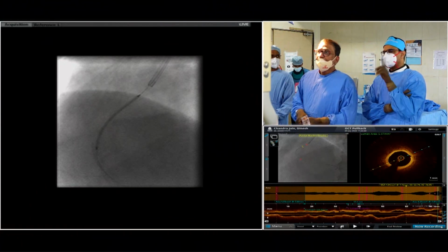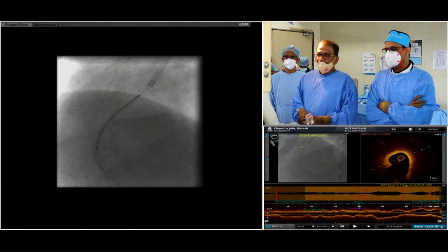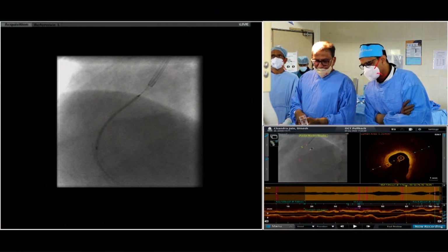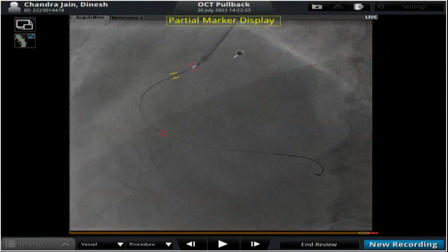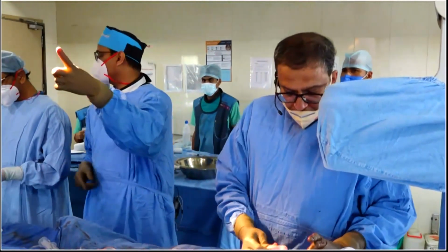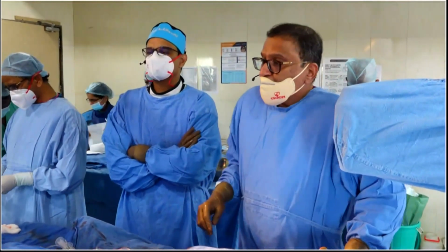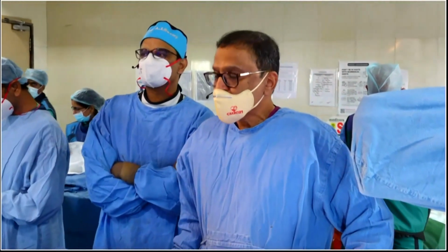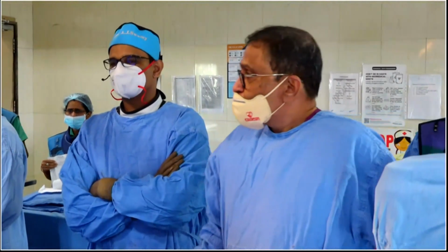You know what, we'll demarcate this. Ajay, demarcate this. We will have to go right now. Yes, sir. You'll do the OCT, and we'll come back to you. Then you show us the OCT. Okay, super. So we have to switch, I think, to Dr. Praveen Chandra. Okay, so you are now back, and you could show us the OCT pictures immediately after implantation of the second proximal stent. Dr. Ajay, you are live.